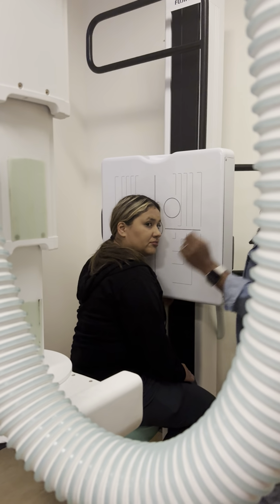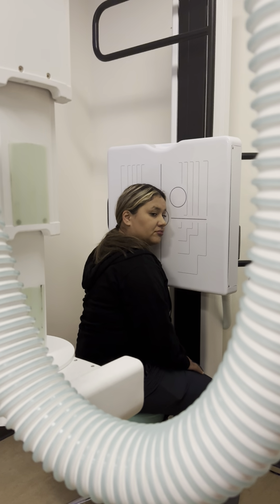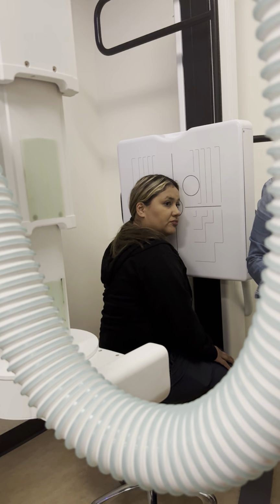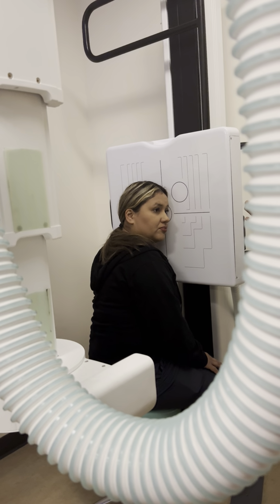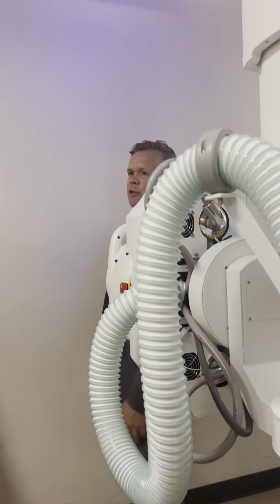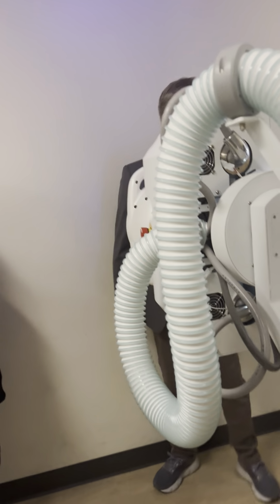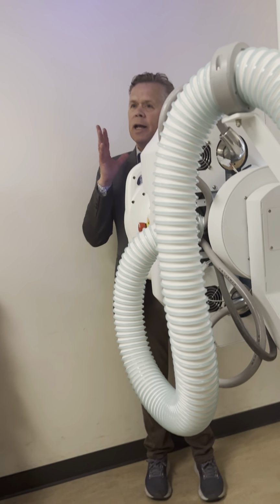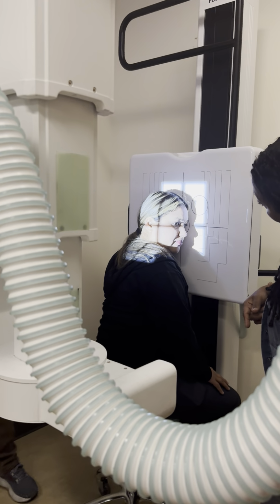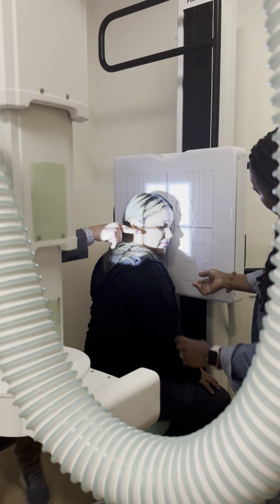For the lateral, the body 70 degrees. That's a great idea, actually. Really what we're doing is just obliquing the patient, because the patient can't get in a lateral for our skull, so we oblique them so they can get as close to the image receptor as possible. That's why we're obliquing instead of just putting them in true lateral. Magnification isn't a big deal on it, because we want to be able to see that, but getting the body part as close to the image receptor as possible is really it. So you're right, you're at the base of the skull and the EAM.